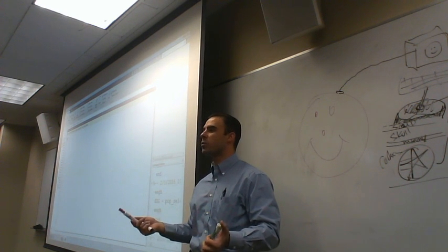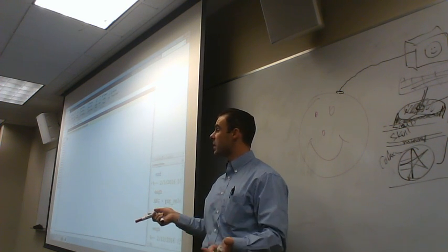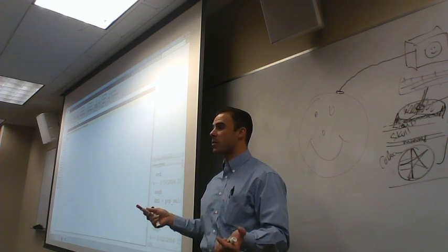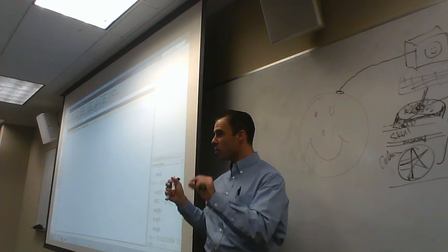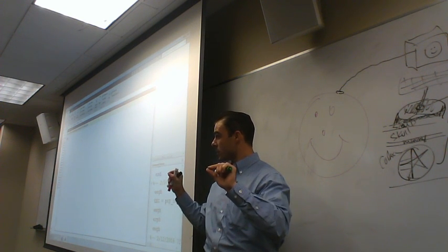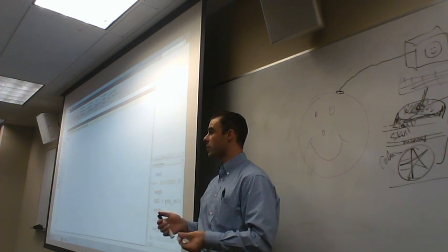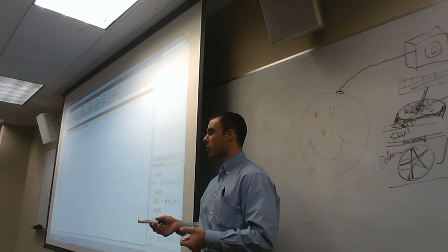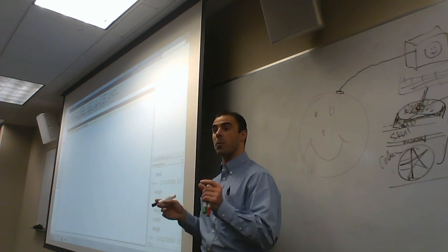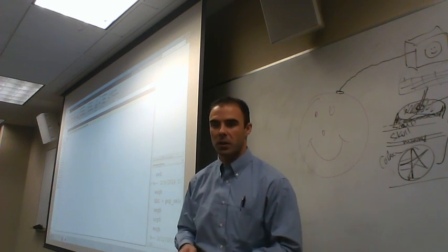And that helps us to give a really good connection, because you guys just spent a lot of time, presumably this week, going through all this data and rejecting some of the artifacts that we identified, correct? Were some of those artifacts just really messy, crappy data? And could you not tell the other times when it was really clean, nice subjects, right? One of the reasons that there can be those differences between when the data is recorded is that there can be better connections, where the skin sites were better prepared. So you guys have seen that now on the data side. We'll look at how that was collected.